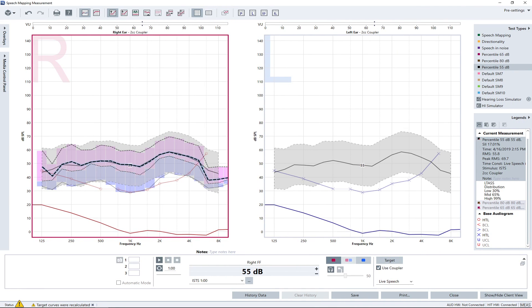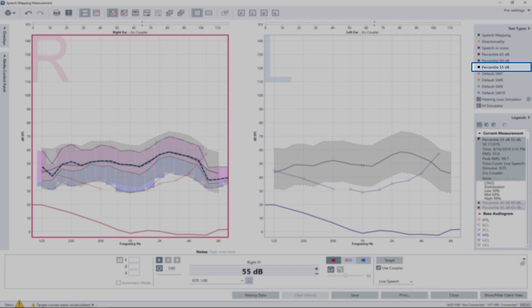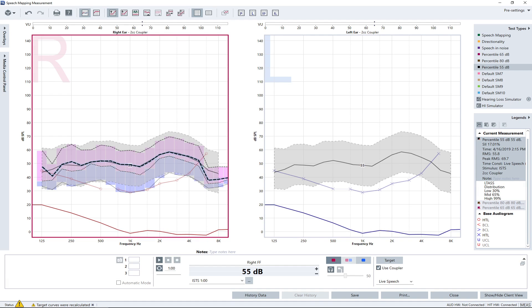Optional step: If necessary, a verification measurement with soft input level 50 or 55 dB can be performed. For low input level, it is not necessary that the soft portions all become audible. Hence it would be acceptable once the target is met with the LTAS that the bottom ends of the blue bars may extend below the hearing threshold level.